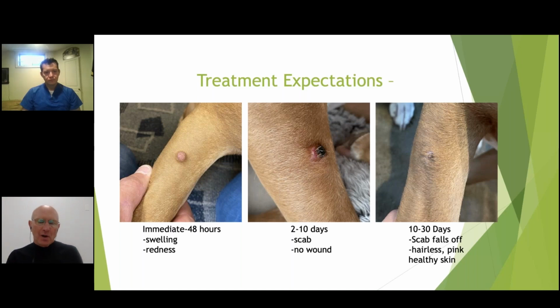The one thing that has also fallen out, especially in the last years as cryosurgery use with these products is growing and growing, is when do you know it's working, and when do you know that maybe your technique needs improvement? The key is, after you do a treatment, within that first 48 hours, there should be swelling and redness that's evident. And then the transition to a scab, because there's going to be an exudate that forms that scab, and then it'll usually be 10 to 30 days later that the scab falls off. But the key is in the first day or so.